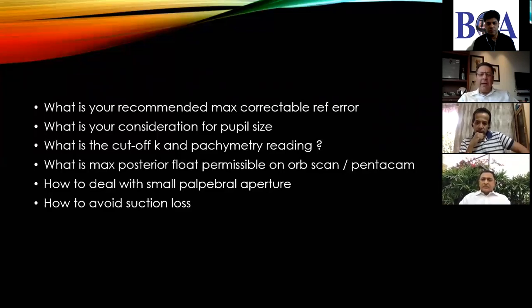But if I have a pupil around 7-ish, I'm not happy to do the case, or I will call the patient back into my consulting because I do the TopoLink readings just before the surgery. I'll call them back and say, you're going to have night problems, do you drive a lot? And all that sort of stuff. And if they're the type whose night activity is important, I won't do the case.